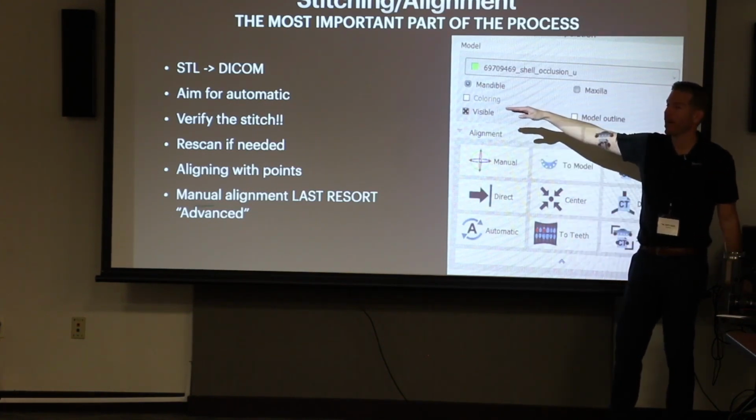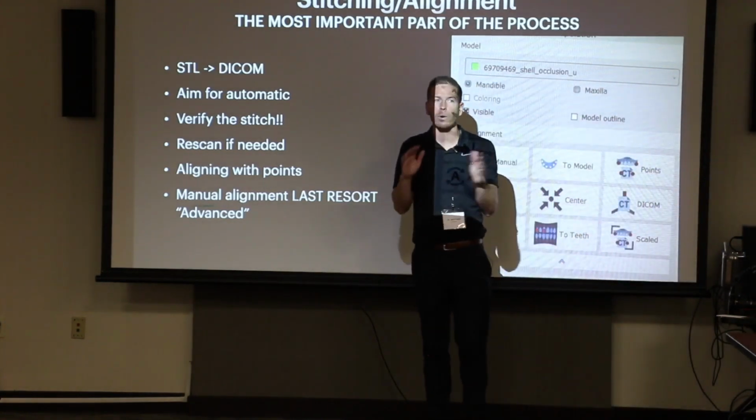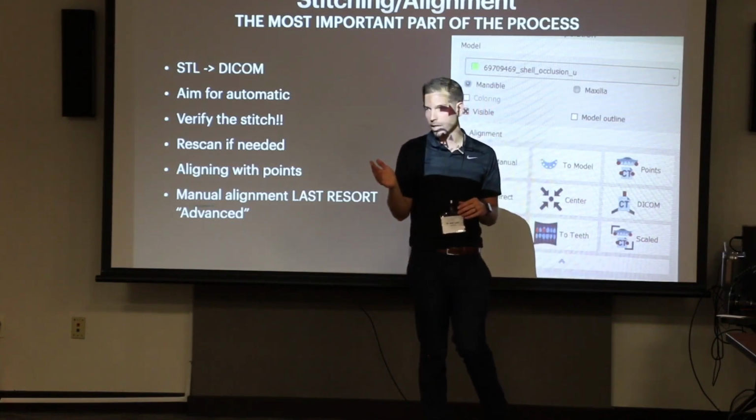We want to aim for automatic. That's the 90% of the time. 90% of the time when you drop these two files into Blue Sky, you don't have to think about it. It's going to say auto-aligning. It's going to auto-align it correctly.